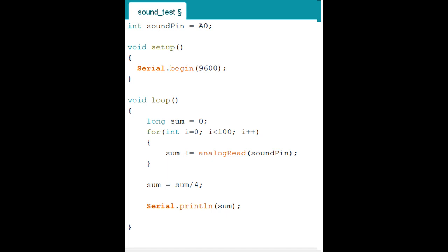So you hit enter, and then for. So we have another keyword called for loop, because loop and for come together. So for is like a condition. Okay, I'm looping, but I cannot loop forever, right? That's a lot of effort and time, and I don't know when to stop, right? So you are giving it a condition. So open parenthesis int. What is int again? Integer, right? So it's a number. I'm going to give you a condition which is a number, and the computer is going to think, oh, okay, the condition is not so complex. It's an integer, I'm prepared, right? So now you tell it, okay, I'm going to call this number i.